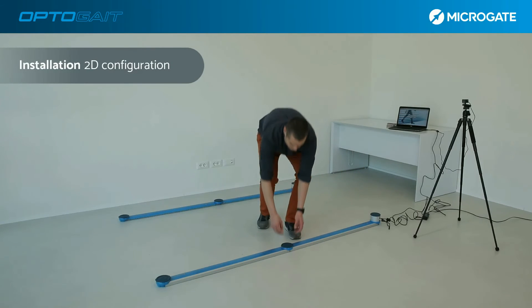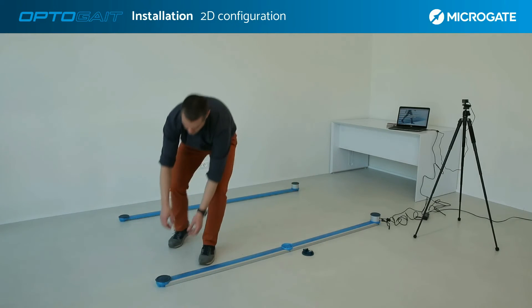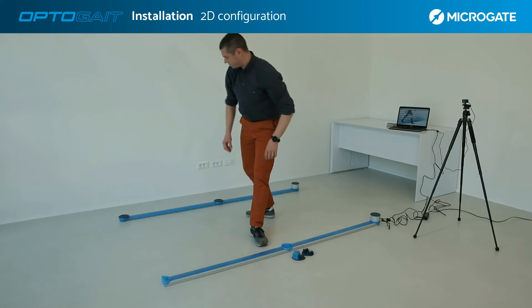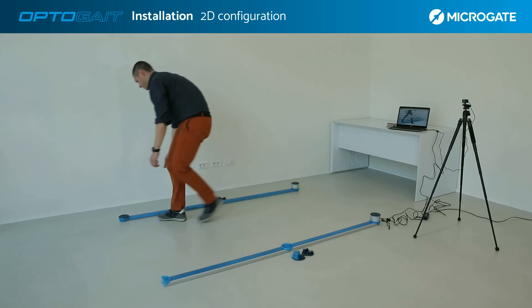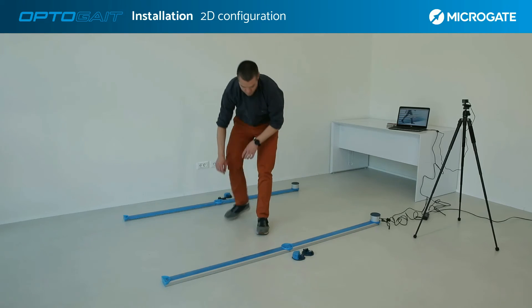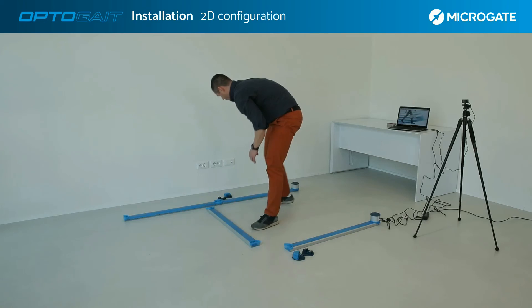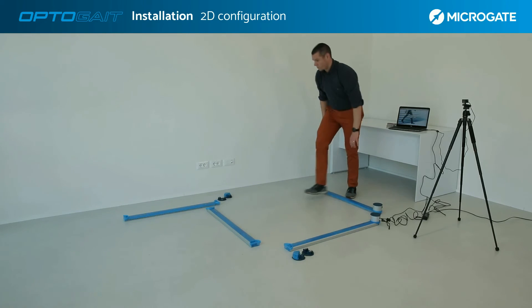The basic kit with an additional kit allows the system to be configured in 2D. To switch from one configuration to the other, it is necessary to remove the plugs and use the flat cables included in the kit that allow 2D configuration. Once the plugs have been removed, rotate the bars as shown in the video. Bring the RX bars closer together with the interface and position them at a 90-degree angle to each other.